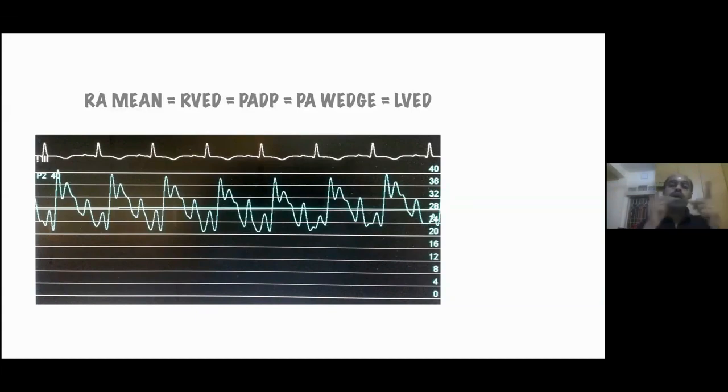A higher amount of venous filling of the RV causes a better RV stroke volume due to Frank-Starling's law. So the RV ejection is increased. There is a low afterload for the RV due to improved pulmonary artery capacitance, so better pulmonary artery filling. All these cause a higher pulmonary artery blood flow. That is what causes the Carvallo sign to be positive. All right-sided events during inspiration are aggravated, but pressures in the right atrium and right ventricle fall. Flow increases, but pressure falls.